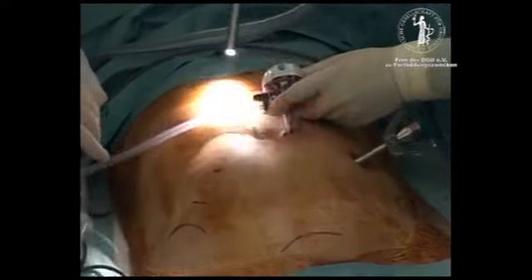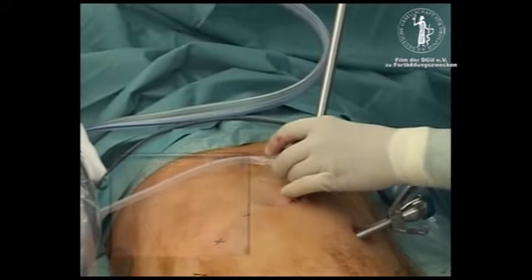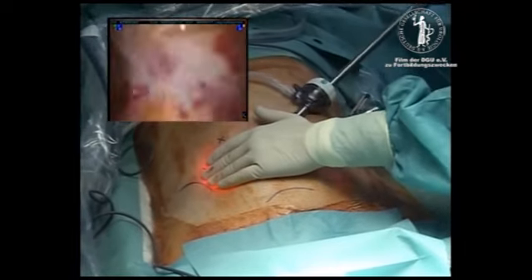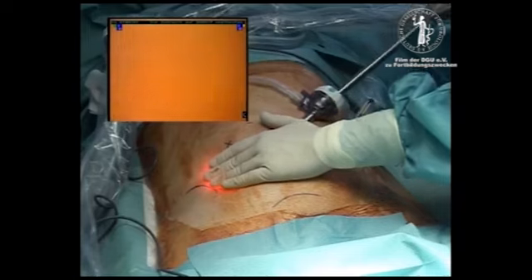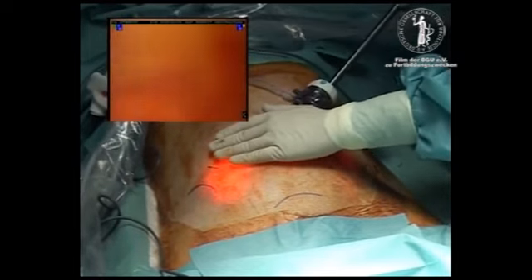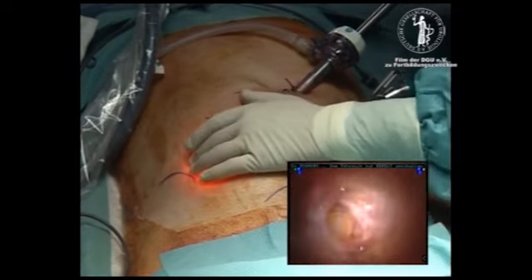An inspection of the extraperitoneal space is performed using the 0-degree optic. The camera can be used under direct vision to increase the size of the extraperitoneal space by gently sweeping the peritoneal borders laterocranially. Gentle pressure of the other hand on the abdomen facilitates this maneuver. The space is expanded by circular movements of the tip of the optic until the second 8 mm robotic trocar can be placed under visual control. Again, pressure of the finger on the abdomen can help in the exact positioning of the trocar.